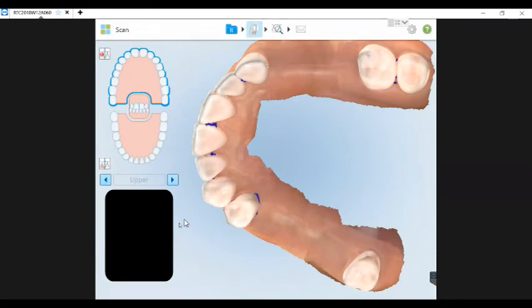You know, I do not sell scanners. I work for a dental lab, NDX, of course. And because of that, my general philosophy in dentistry is you use the materials that are in the best interest of that prosthesis that you're making for the patient. So if the patient is that challenging, sometimes you're going to need to go to PVS, or you're going to take some sort of an alginate preliminary impression and ask for a custom tray. And there's nothing wrong with that.